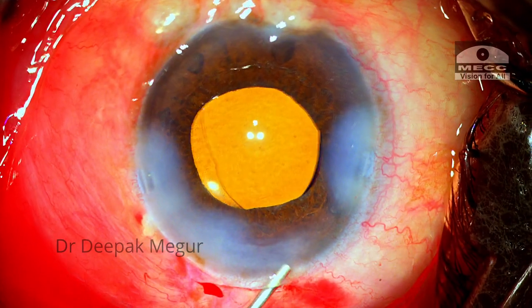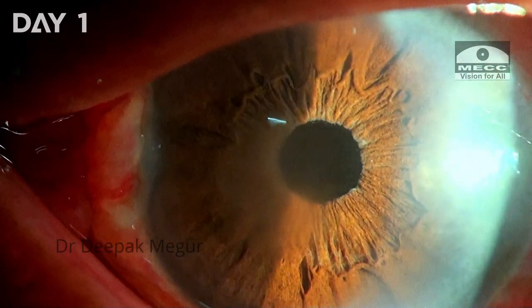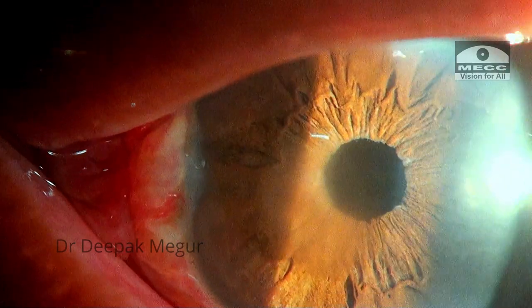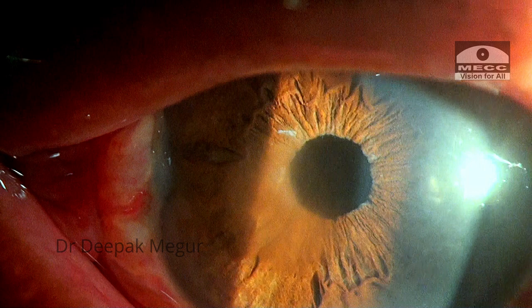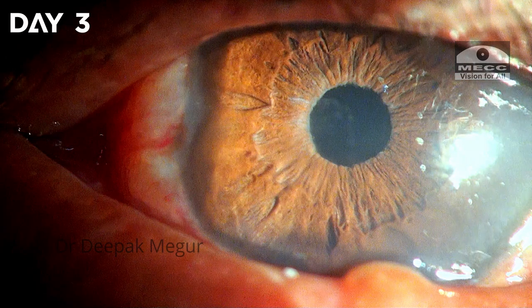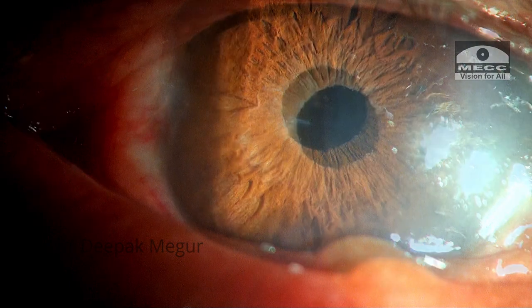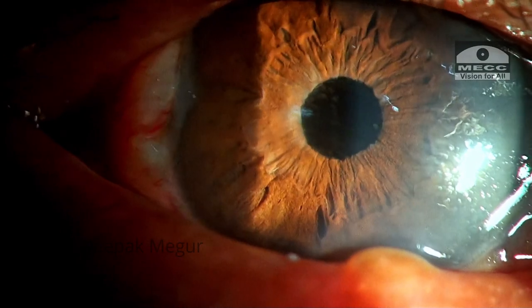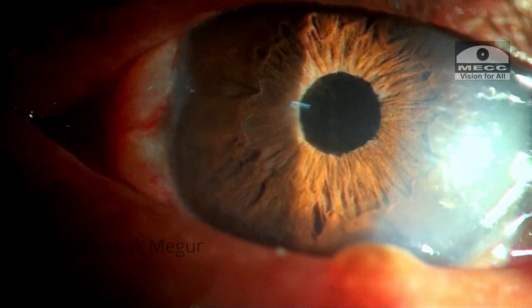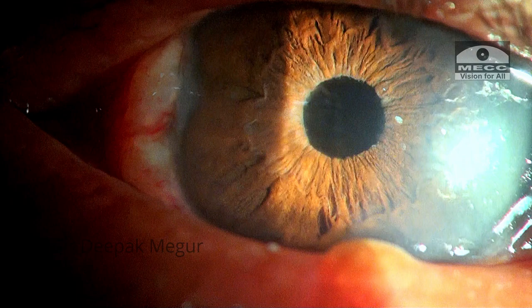On the first post-op day, there is some corneal edema and the pressure is 28 mmHg. Some retained OVD has probably caused this spike, which is to be expected in an eye with pseudo-exfoliation that already has a compromised outflow. With anti-glaucoma medications, the pressure comes down, the cornea clears, and the vision is significantly better. The patient continues to do well.